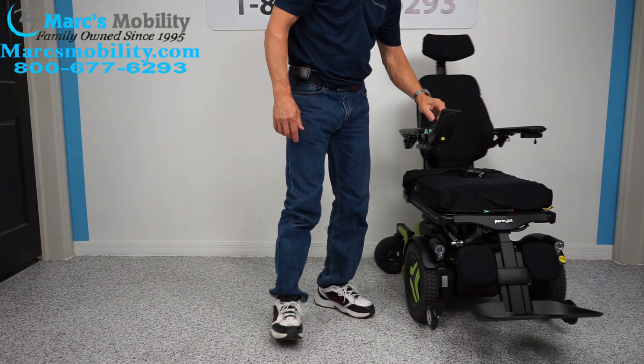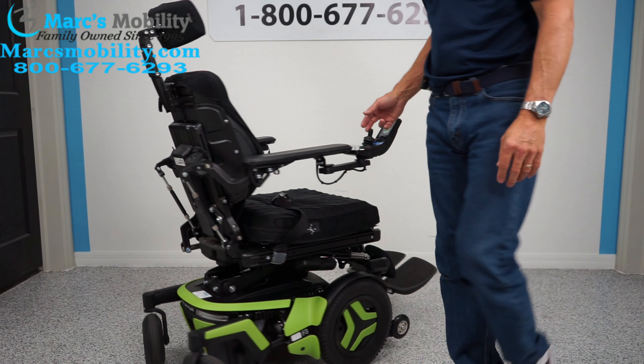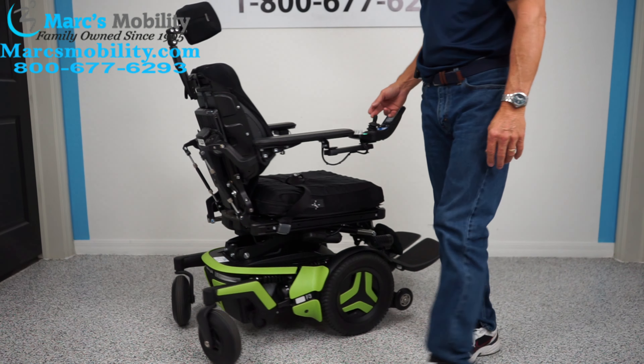This is a front wheel drive, so this is how it's going to turn in your house. If you have it in your house, that's what you're looking at — that's what it looks like.